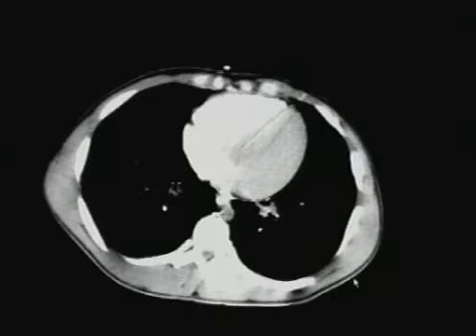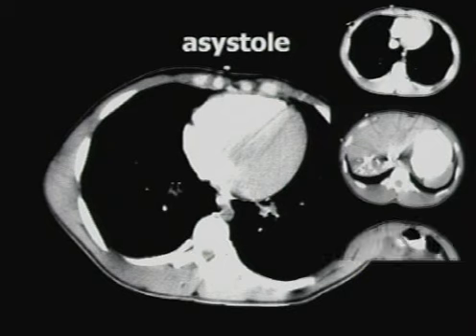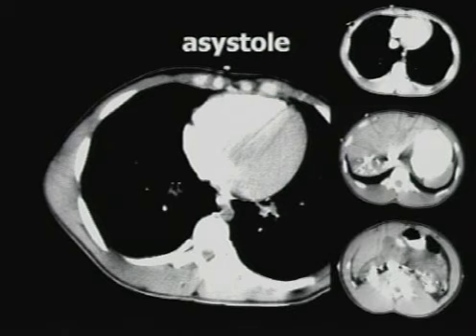And lastly, I'll leave you with this image, hopefully something we don't ever see. This is that kind of yin and yang appearance. When I saw this, I started telling my colleagues, wow, I scan dead people. This is asystole. This patient had already had his CT of his head and his face and his cervical spine, and during the contrast injection, the patient actually arrested on the table. The scanners are so fast these days, we wound up beating everybody into the room to treat the patient, but we wound up with some pretty pictures of contrast refluxing into the right side of the heart, down the IVC, refluxing to the right hepatic vein, and refluxing into the renal veins. So something we hope we don't end up seeing.